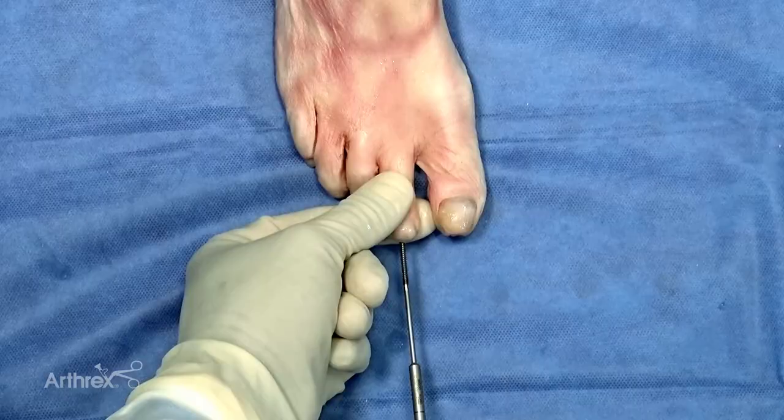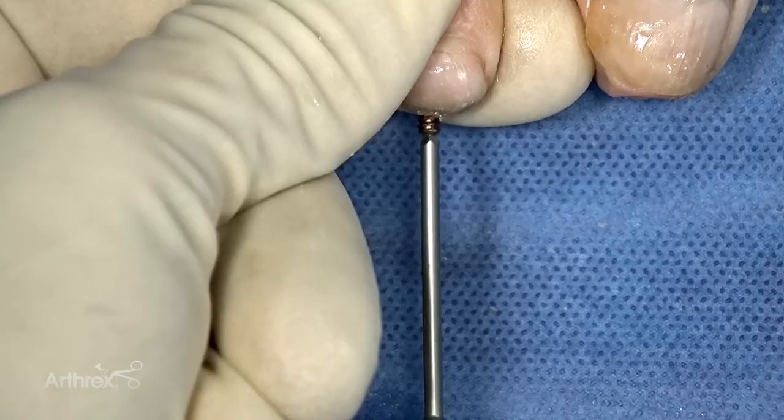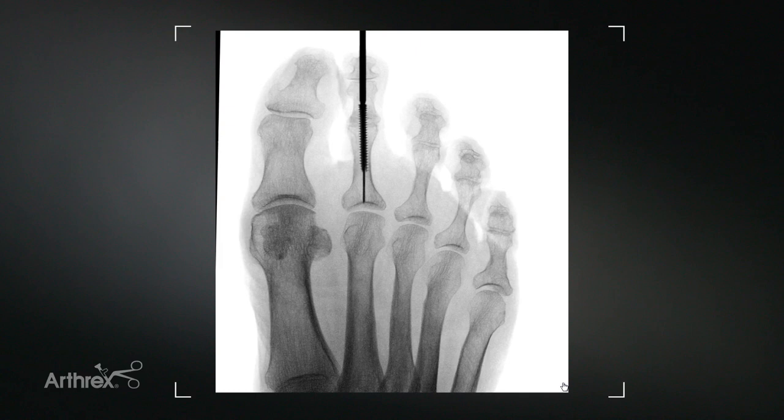The screw is inserted on power, and it is important to stabilize the IP joint while it's being inserted. Image intensification is done at this point to make sure the screw is in the appropriate location. You can see I've achieved excellent compression across the IP joint. I've maintained alignment, and I've placed the screw in the location I was aiming for.